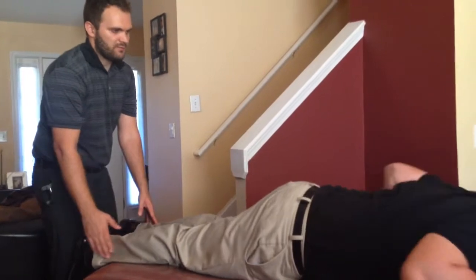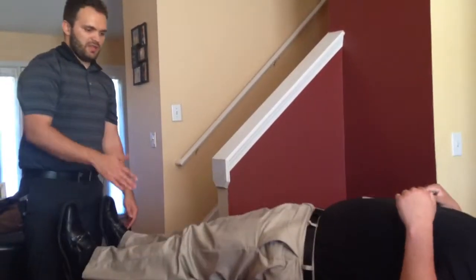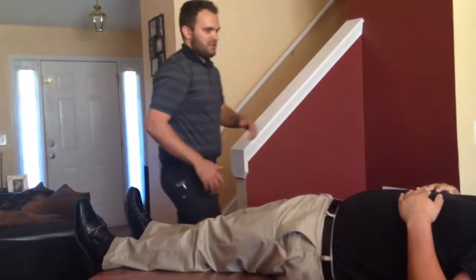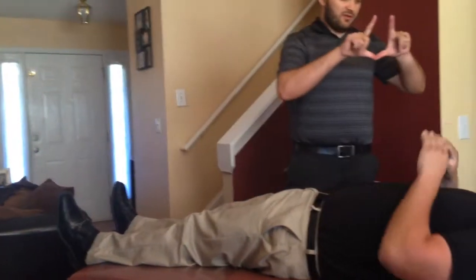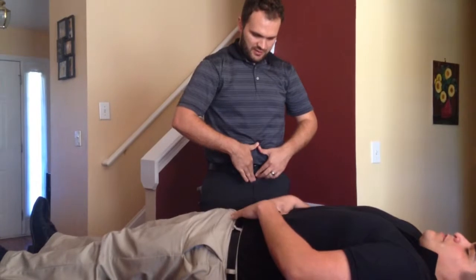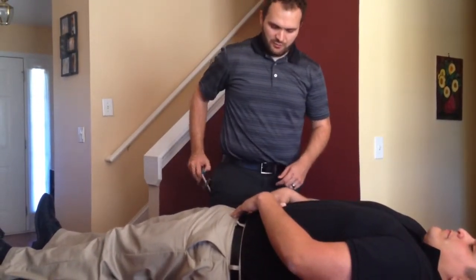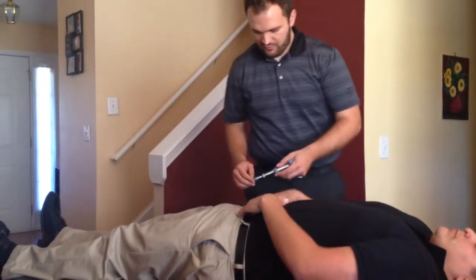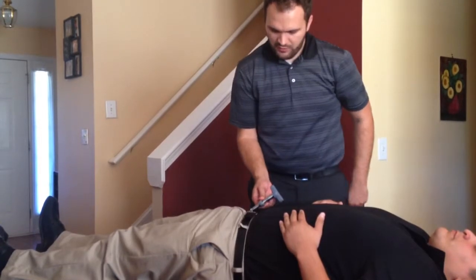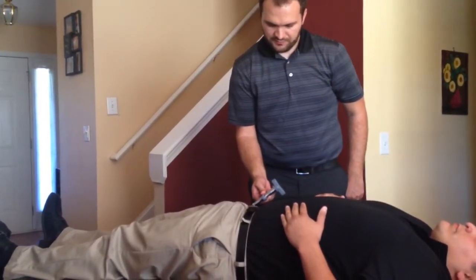Can you lay on your back for me? All right. It's important to keep in mind that when he flips, the short leg switches sides. So this is his short leg side now. Can you take your fingers and make this shape and put it in your belly button and just press down? Now can you find there's going to be a bone right there. I'm going to take the integrator. You can lift your hand up. I'm going to fire in a superior, inferior, anterior, posterior line of drive just like this.